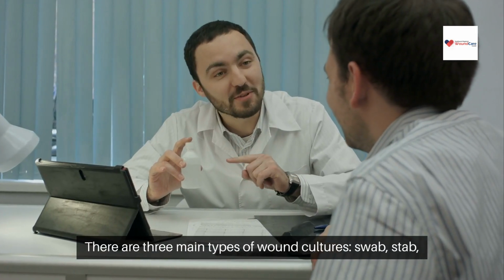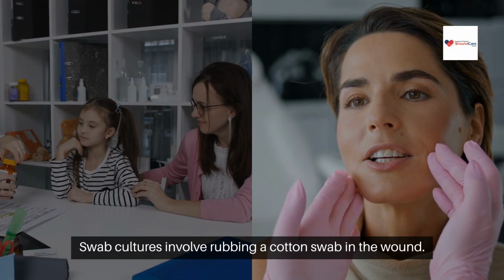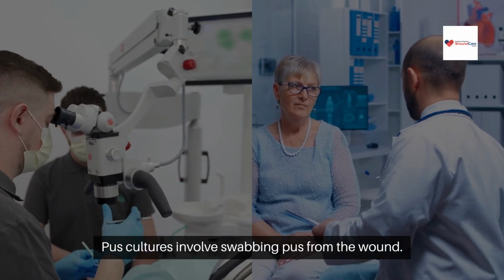There are 3 main types of wound cultures: swab, stab, and pus cultures. Swab cultures involve rubbing a cotton swab in the wound. Stab cultures use a sterile needle to obtain a sample. Pus cultures involve swabbing pus from the wound.